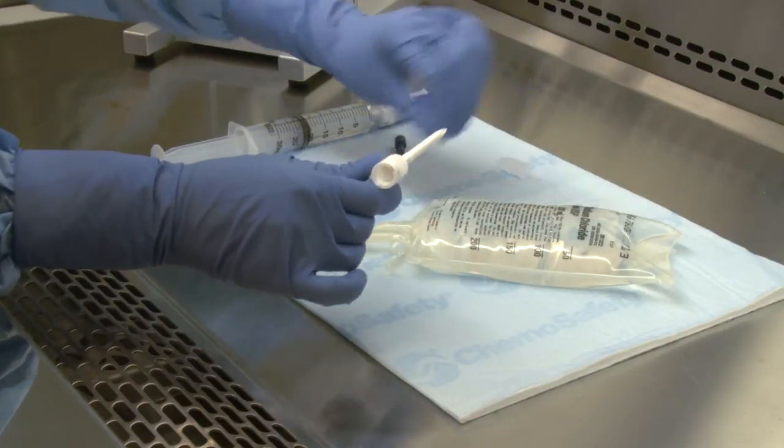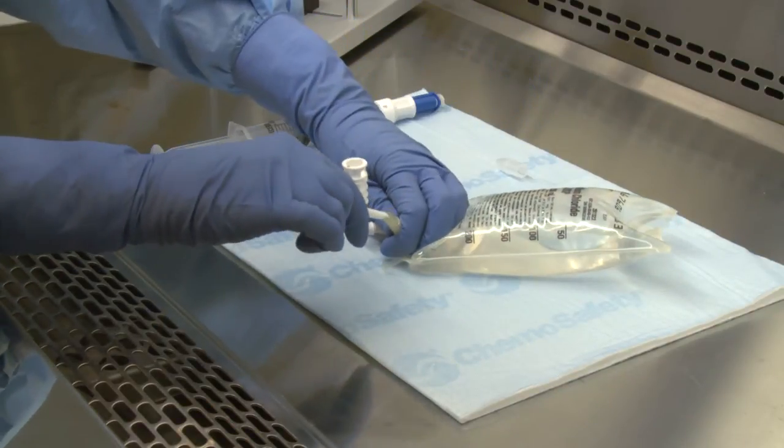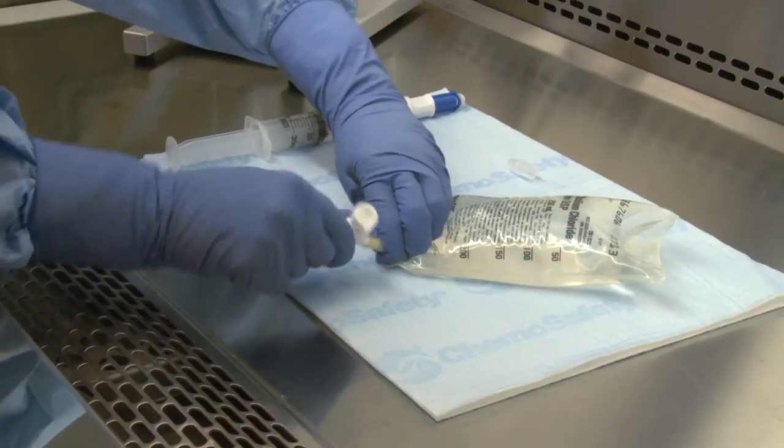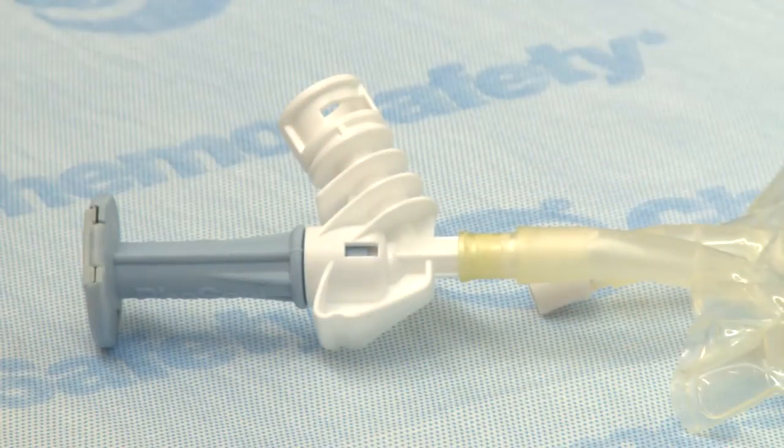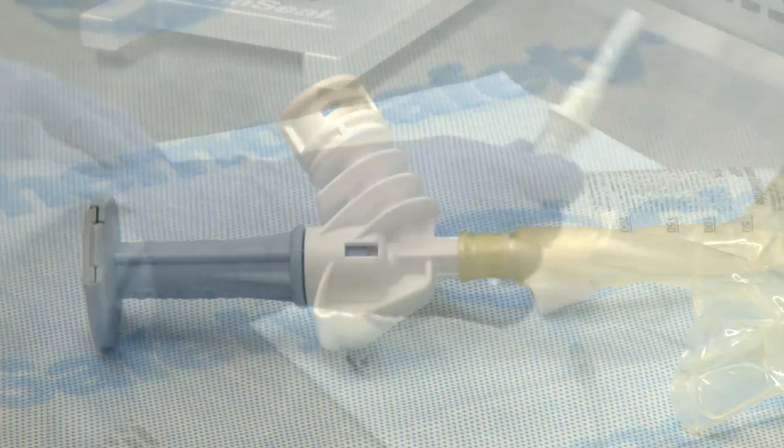On a flat surface, spike the IV bag with the BD-facil infusion adapter. Ensure the spike of the infusion adapter is fully inserted by confirming the port of the IV bag is up and over the shoulder of the infusion adapter.